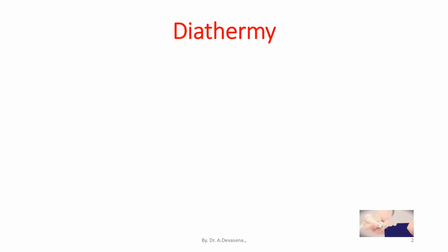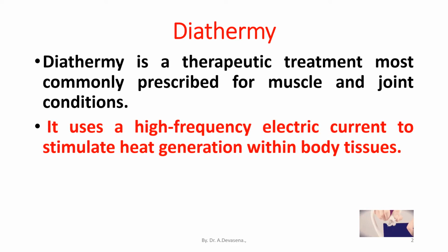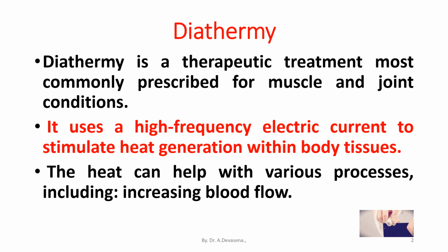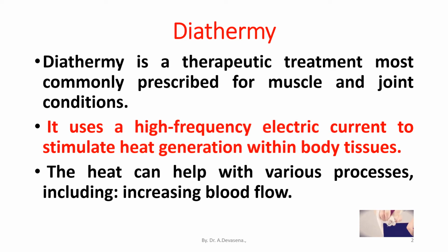Diathermy. Diathermy is a therapeutic treatment most commonly prescribed for muscle and joint conditions. It uses a high-frequency electric current to stimulate heat generation within body tissues. The heat can help with various processes including increasing blood flow.